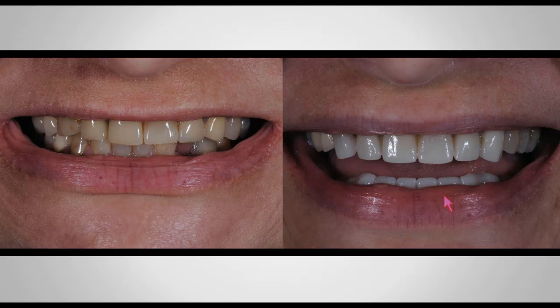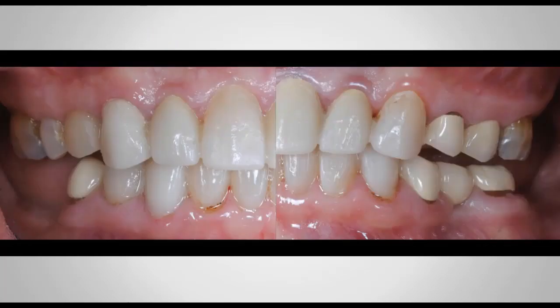So this is what I like about this particular splint for vertical dimension, that this splint, if you call it that way, is bonded to the actual teeth of my patient, crowns and teeth in her case. So you can see no posterior contacts whatsoever. She only had anterior contacts, and that's how I sent her home for 15 days.